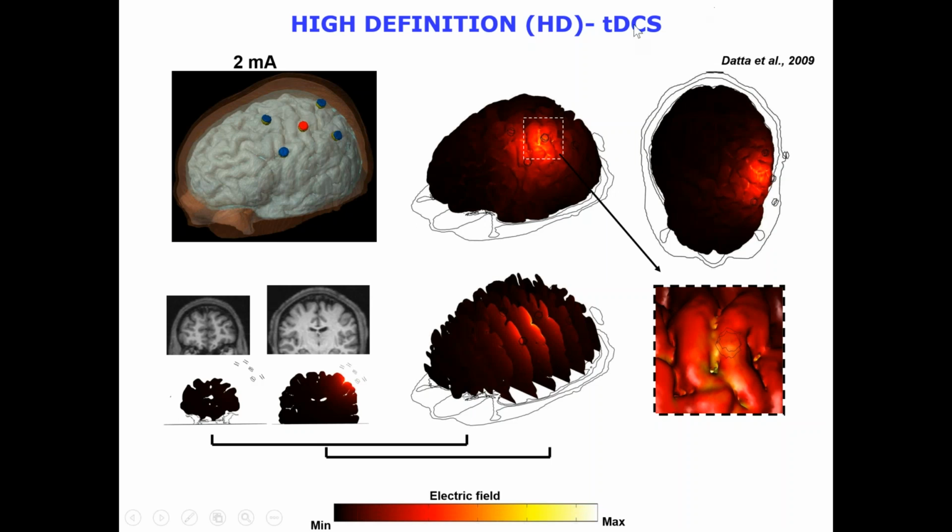One is called alternating current stimulation, what we call tACS, which we're experimenting with in our autism protocol. So a patient would come in, like you just saw on these other images, and they would get one form of neuromodulation. A lot of times we start off with an active form of neuromodulation, which is called neurofeedback.